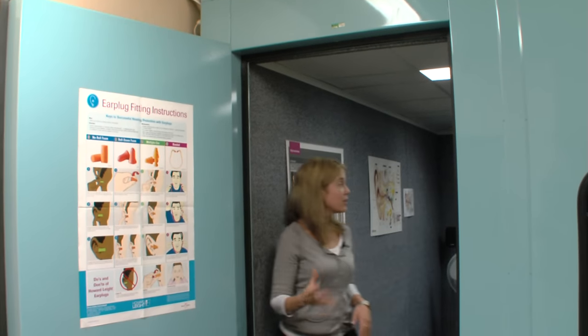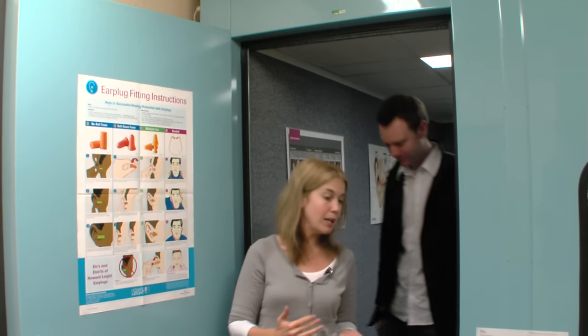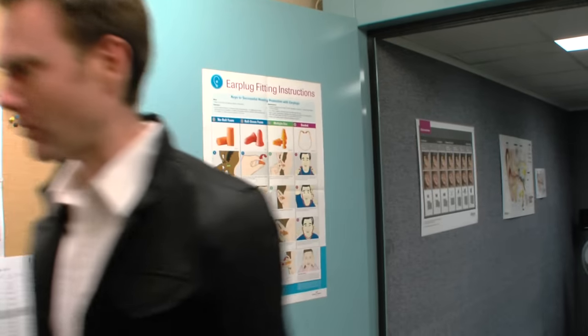Looking at these low into the mid pitches here, your hearing's looking absolutely fine. What's happening is as we get into these higher pitches, it's sloping off down to a more mild through to a moderate hearing loss, just at the very highest pitch there. A formal report is usually prepared and sent to the client, as well as to other relevant health professionals. What I'll do is write out a full letter with a copy of the results and send them out to you in the mail.